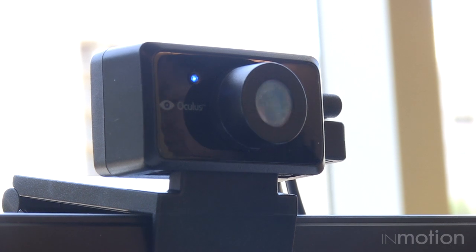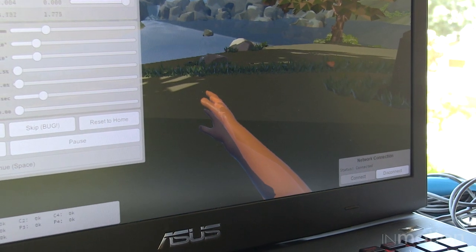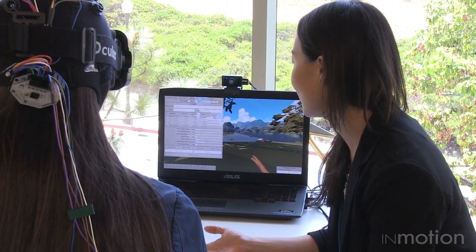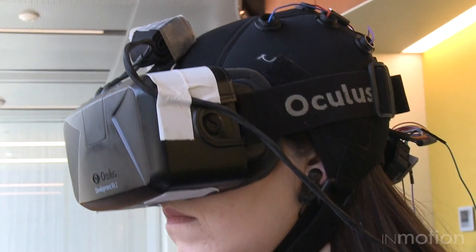Okay. We take signals from your brain, and we take signals from your muscles, and when those signals indicate that you're trying to move, then in virtual reality your arm moves, even if your arm doesn't really move in the real world. I want you to try to move your hand towards the target position, okay? But we're going to have you do it just using your brain activity.